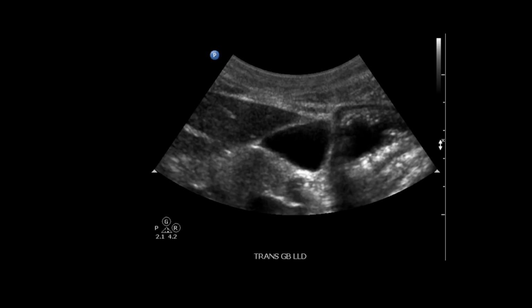After elongating the gallbladder in the LLD position, again, we will take a transverse image. Remember again that the gallbladder has kind of fallen more dependently, which is typically a little bit further outside of the liver. Sometimes this makes it easier to visualize the gallbladder in its entirety. Here we have the transverse gallbladder, again labeled in the LLD annotation. We can see that it's taken on a little bit more of a triangular shape, but it is still much rounder, or obviously in the short axis compared to our previous picture that was in the long axis.